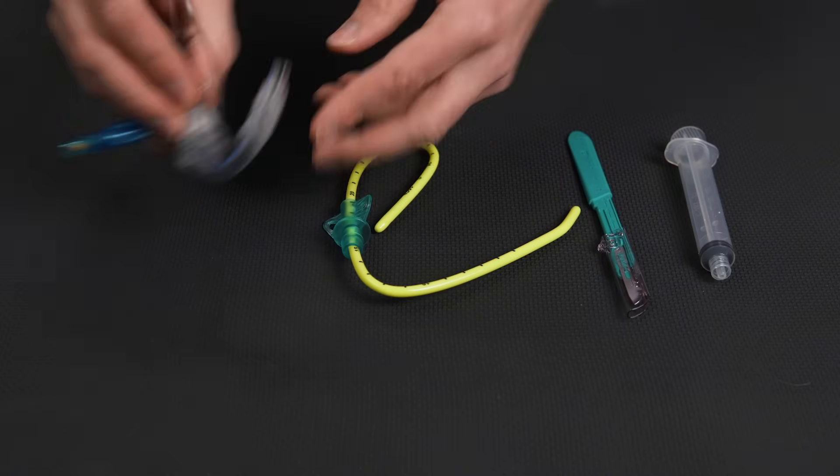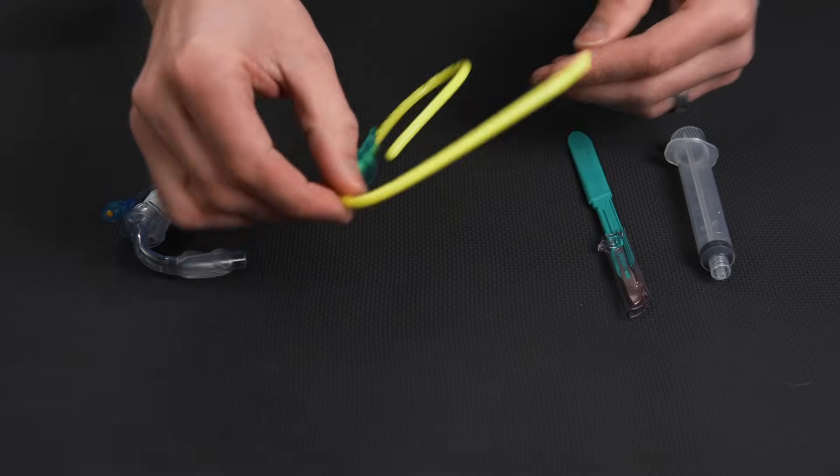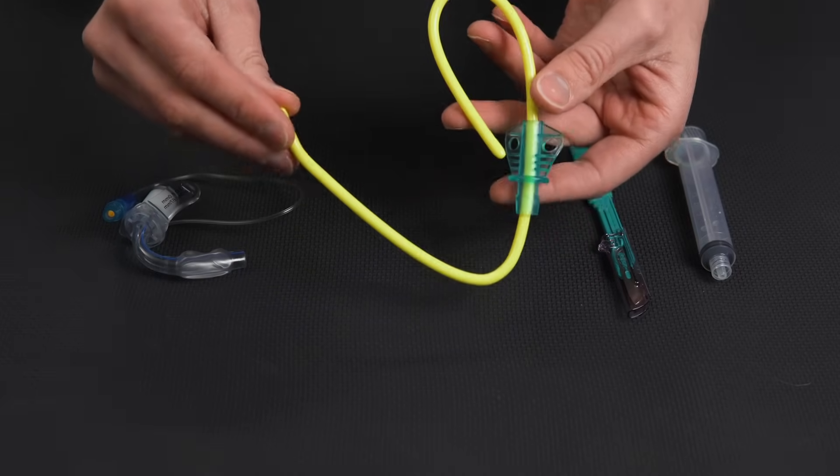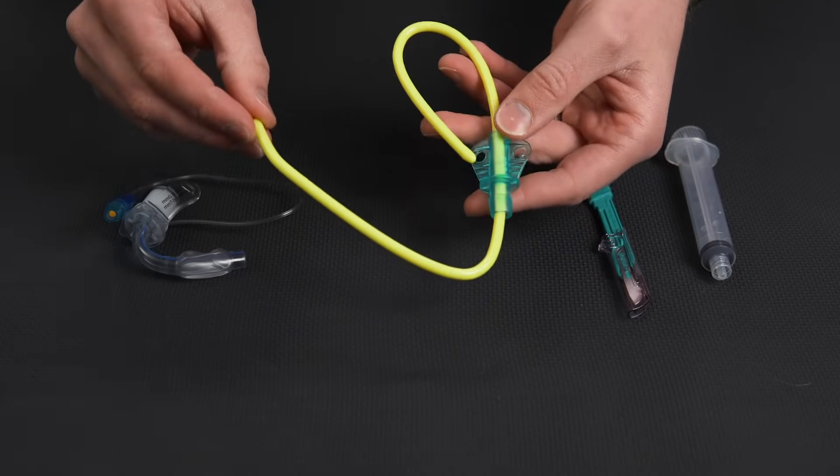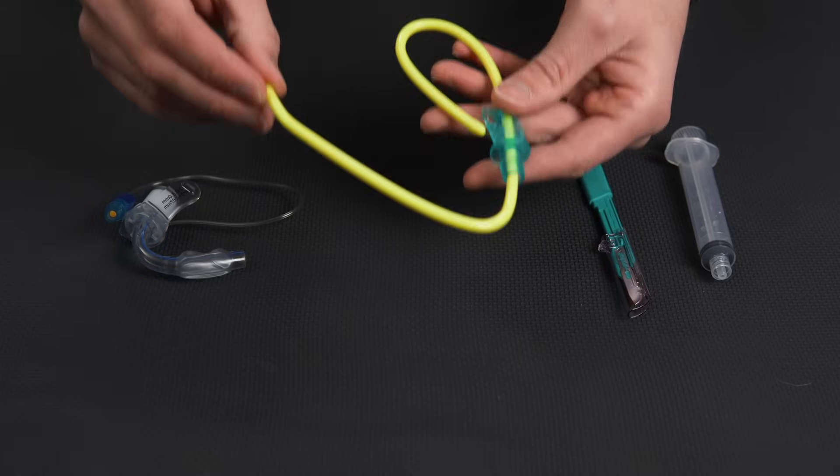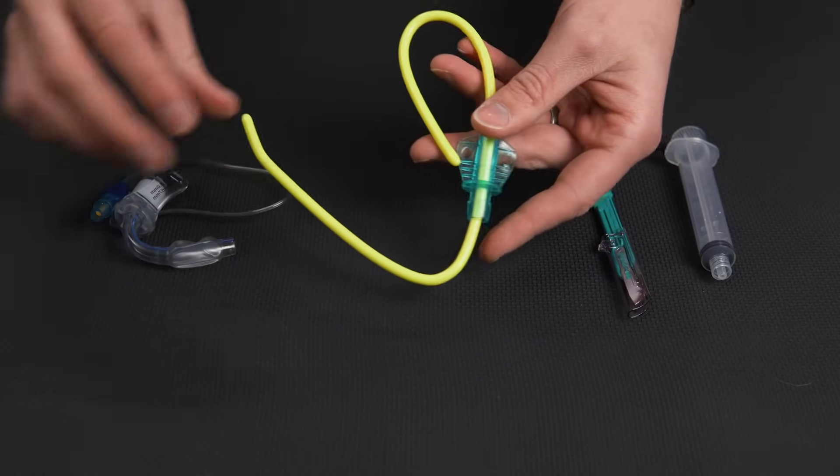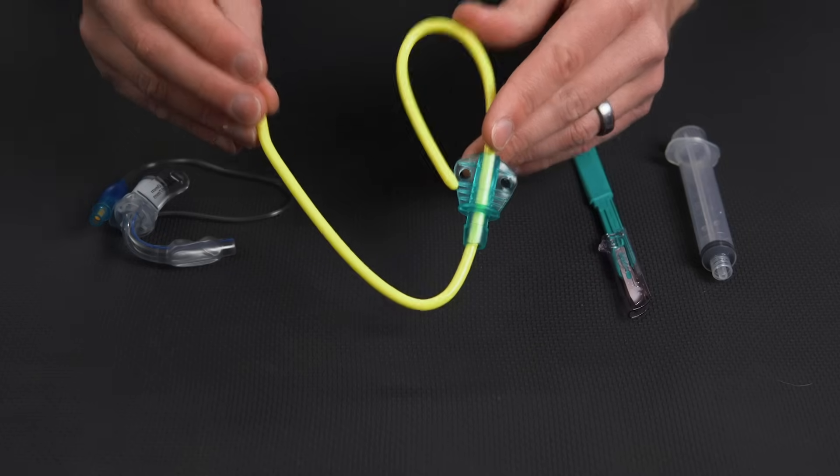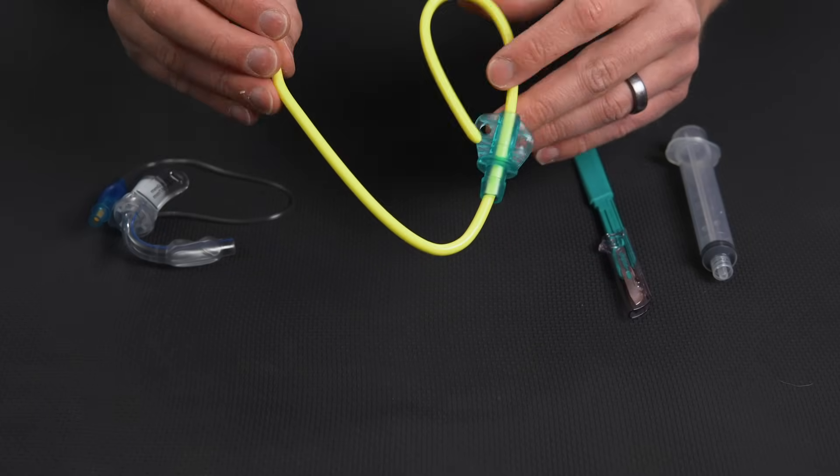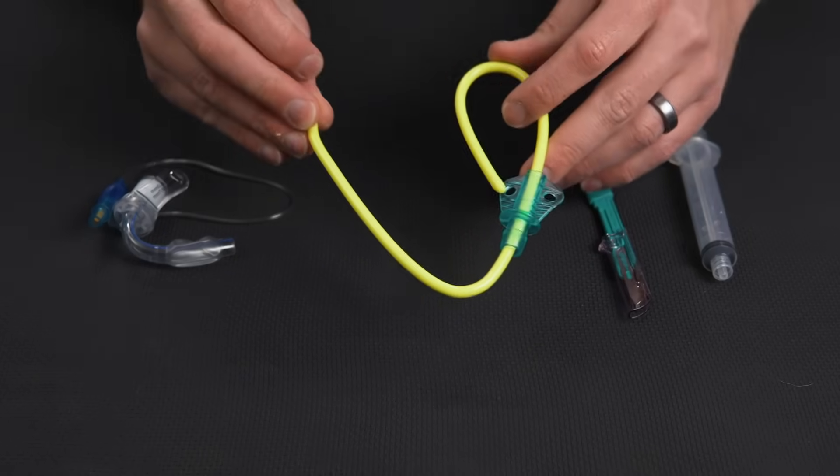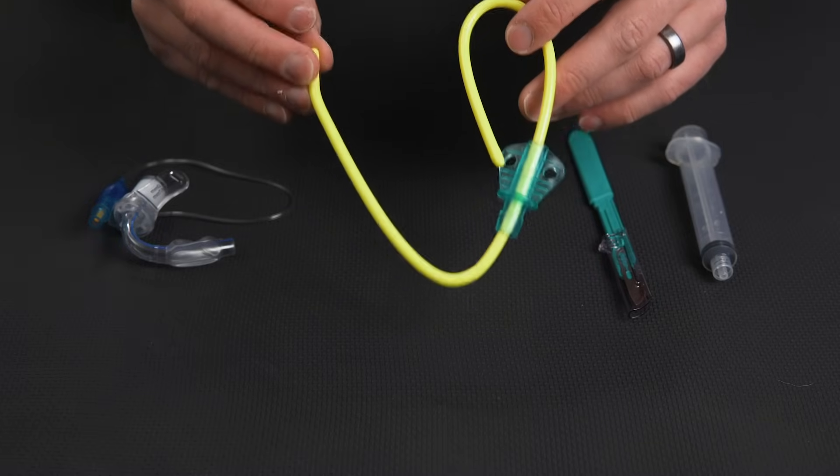Now the second thing you're going to need is some kind of introducer. I like to use bougies. This one is a specialized one that actually comes with this tube preloaded on it from North American Rescue. This just allows you to get this in place and secure the tube and not lose your spot.